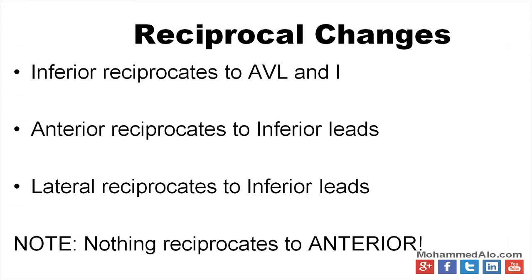So reciprocal changes are very, very important. The inferior leads reciprocate to AVL and 1, mainly AVL. Your anterior leads reciprocate to your inferior leads, and your lateral leads also reciprocate to your inferior leads. So if you have ST elevations in your anterior or lateral leads, you should always have depressions in your inferior leads. If you have inferior elevations, you should see AVL and 1 being depressed.